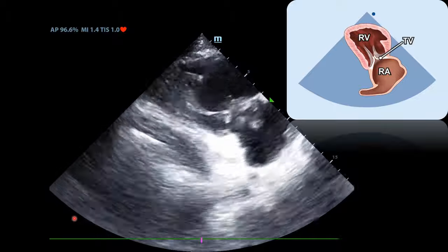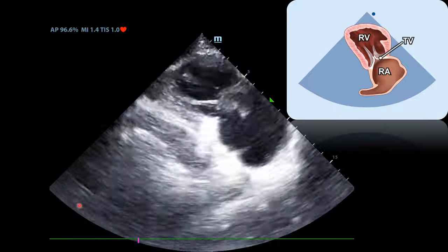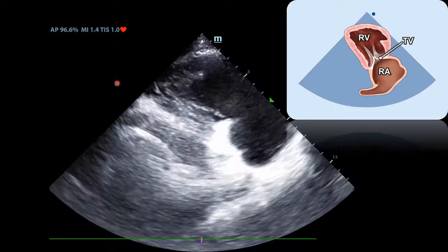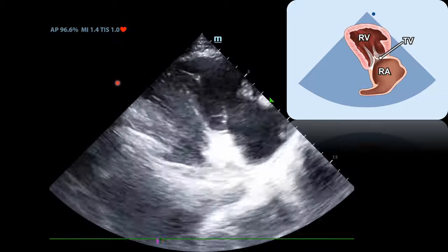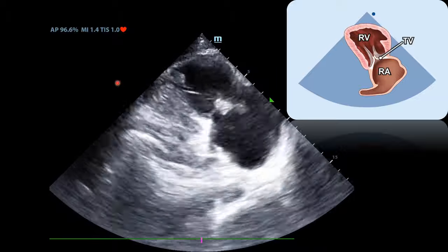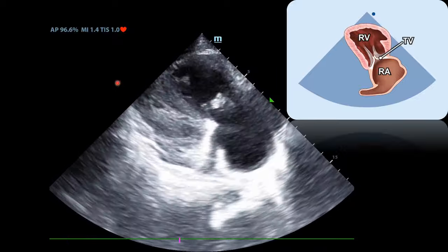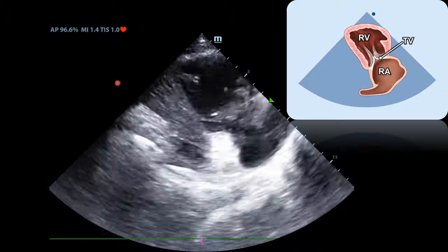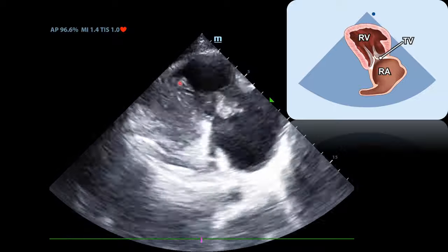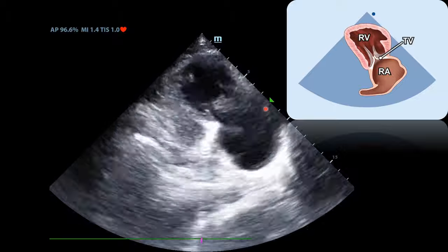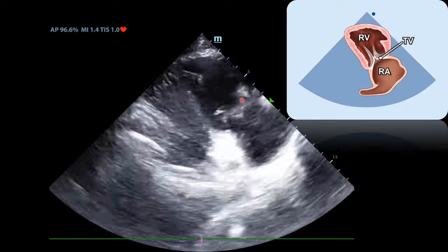Next, we'll move on to an infrequently obtained view in point-of-care echo called the RV inflow view. What happens is you take your parasternal long axis view and tilt the tail of the probe to the patient's left shoulder, so you get a more anterior view of the heart. Remember, the RV is a more anterior chamber. You'll notice that this is the RV, this is the RA, and this is the tricuspid valve.